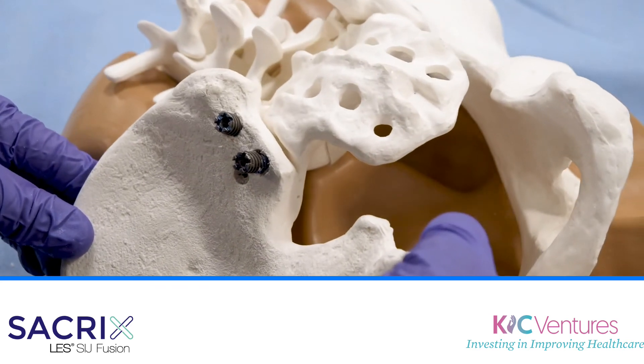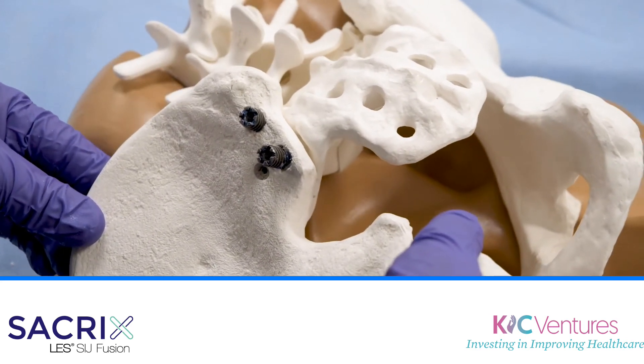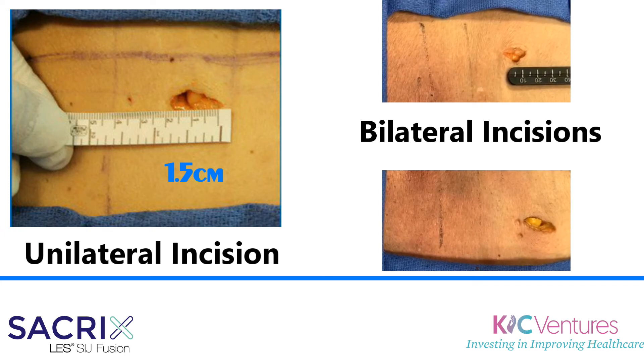It's going about 20 degrees across the joint. It should be less than 10 minutes for a screw, and it's going to be a single incision.